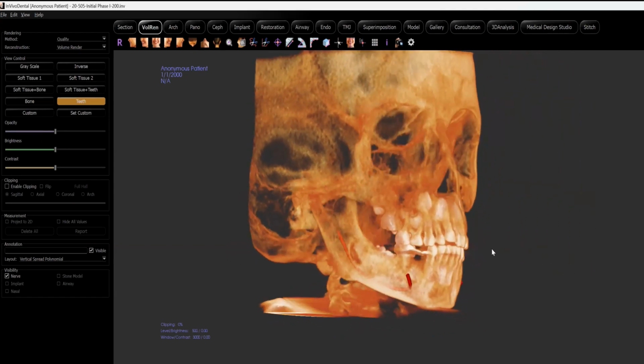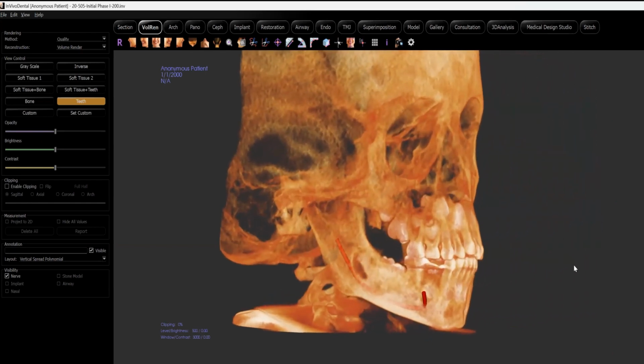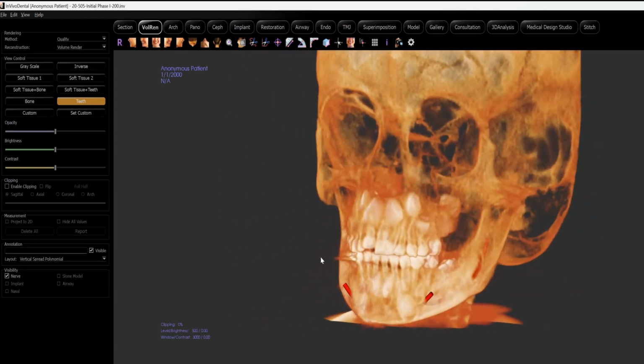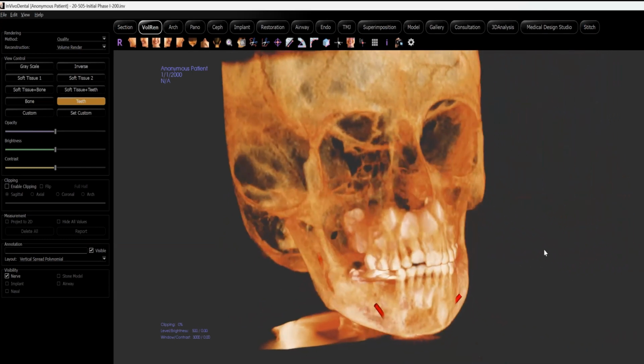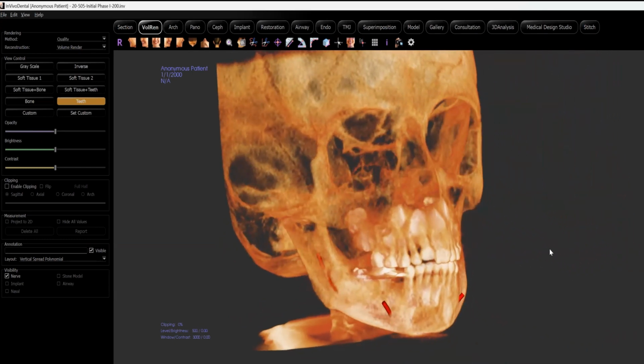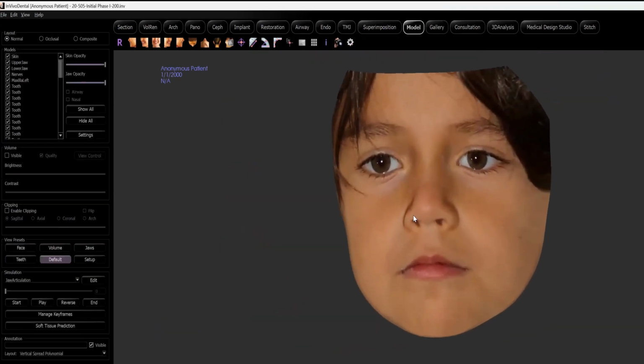For those who have it, know what I'm talking about. So you can see here that the image is, again, accurate, but it's not quite clear. So there's not really noise there, but there's a lack of clarity. Okay, what the in vivo model product is doing is taking this data set and performing a process called segmentation and surface mapping of all the elements, including the bone, the teeth, the hard tissues, the nerves, and you get a product known as the in vivo model.